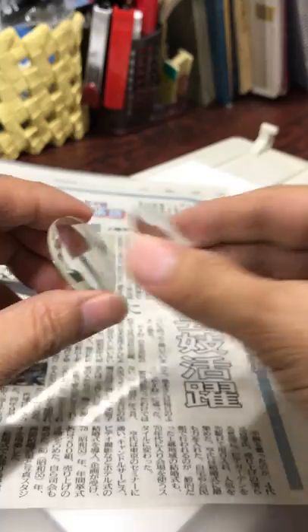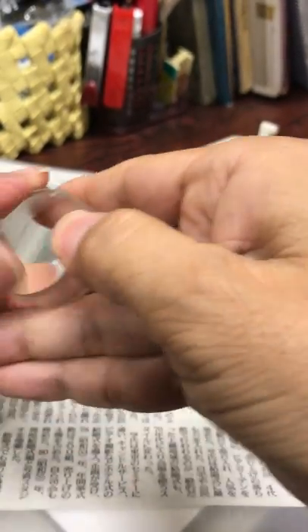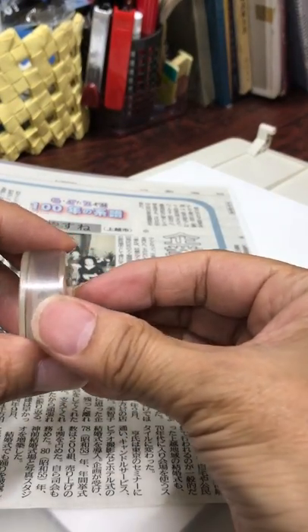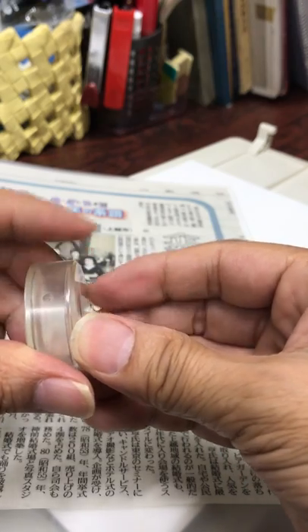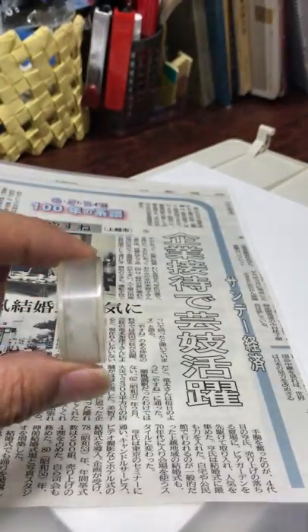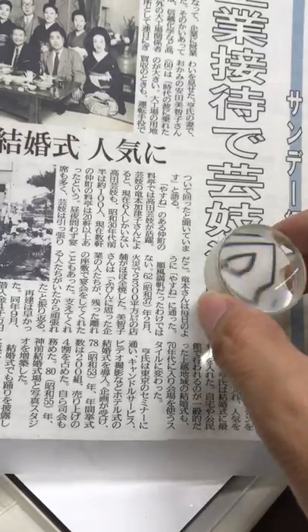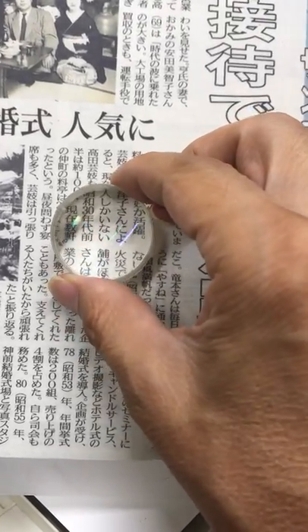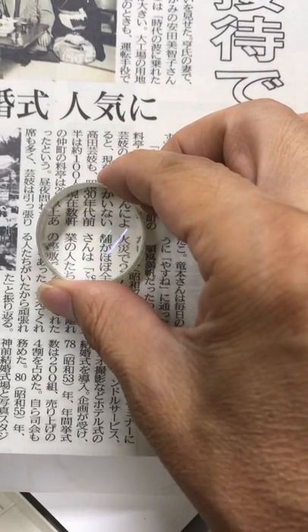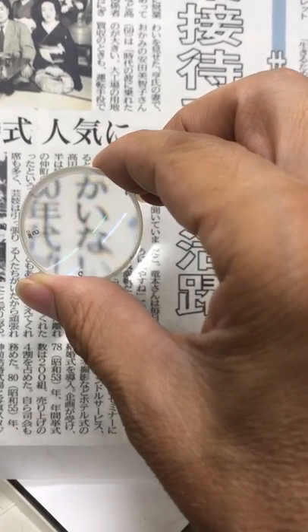And then, I attach the two parts into the ring and make an aplanatic lens. Let's see the newspaper through the aplanatic lens. It can reduce spherical aberration.